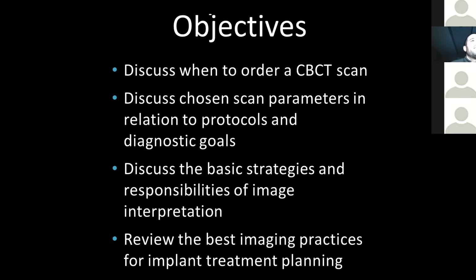So Dr. Schiffman, who I know, asks me, what imaging, if any, is needed to evaluate a symptomatic TMD patient at the initial consultation before any treatment has been implemented, including home-based self-care? Oh boy, Dr. Schiffman, it's great to hear from you. To that, I would say if you as the clinician feel that you're suspicious of anything going on clinically that could change your initial treatment plan, you should be looking at imaging.